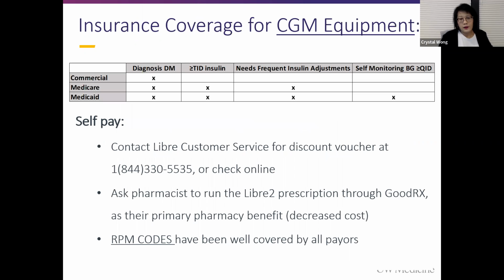Okay, all right, so we just talked about inclusion criteria. So, purely medical: what features of a patient make them a good fit? Now you have to overlay insurance coverage. And the mindset that I'm trying to get providers to adopt is that it's just like prescribing a medication that maybe some insurances only cover for certain diagnoses, or where you have had to try something else before. That's exactly what you should think about with CGM, in that same pot.